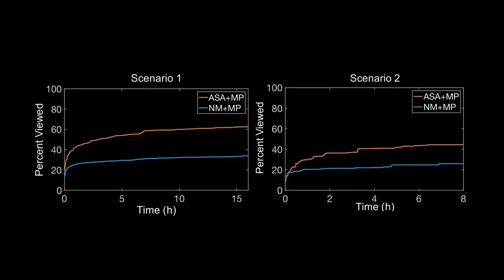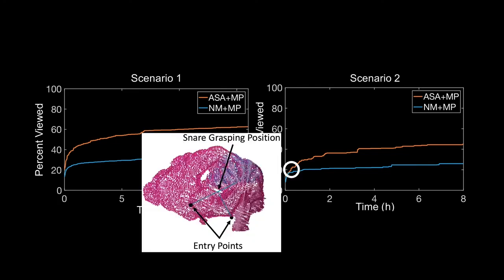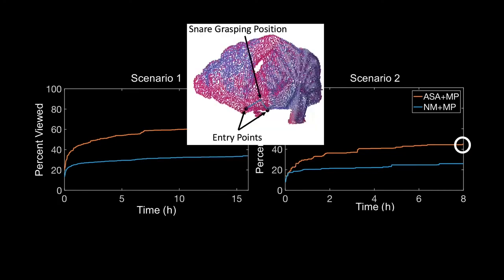In both cases, the method performs well, allowing us to go from designs that are able to visualize a small portion of the anatomy, such as is shown here for scenario 2, where the purple points are the visualized points, to designs which are able to visualize a much larger percentage of the anatomy, such as shown here.